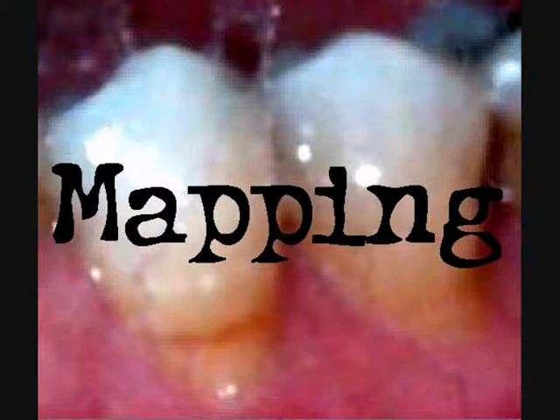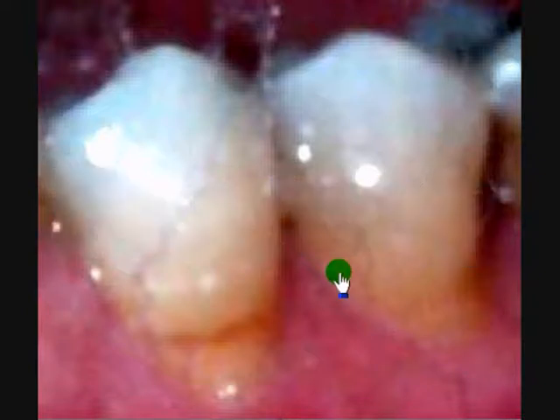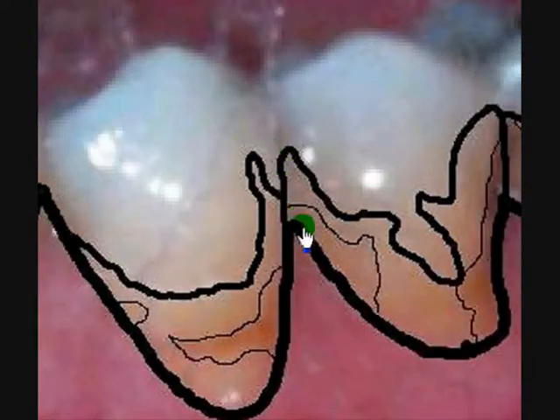So let's get back a minute to how we magnified those two premolars, and let's try to understand how we get on with this technique. Now, mapping is just like a map. Matter of fact, you see, after I have magnified the two premolars, I have separated the body colors from the enamel. And even the body where there's more intensity, like in these areas, I have separated them as well.